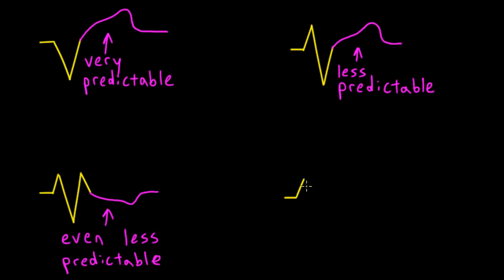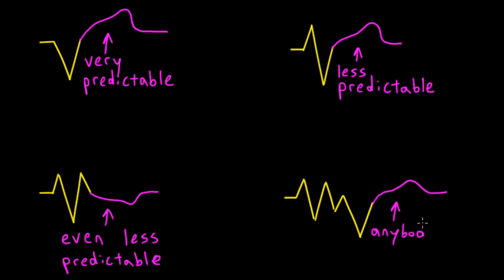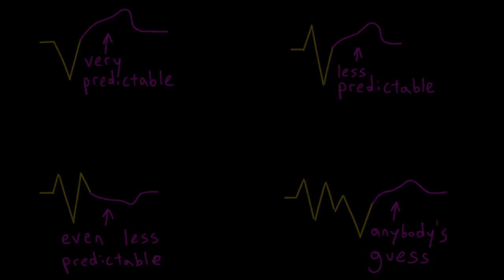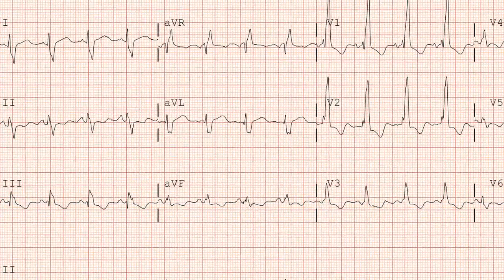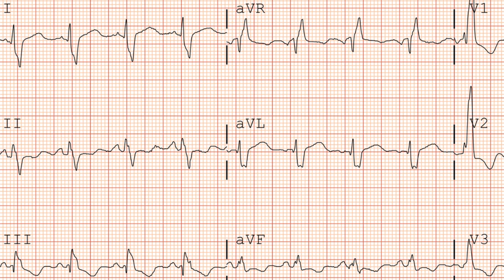Coming back to the last EKG we looked at, let's carefully look lead by lead and ask ourselves if these ST segment and T wave changes look expected or unexpected. Start with the limb leads — look carefully at the QRS complex in each lead and ask yourself if the ST segment and T wave changes that follow are typical of a secondary repolarization abnormality.